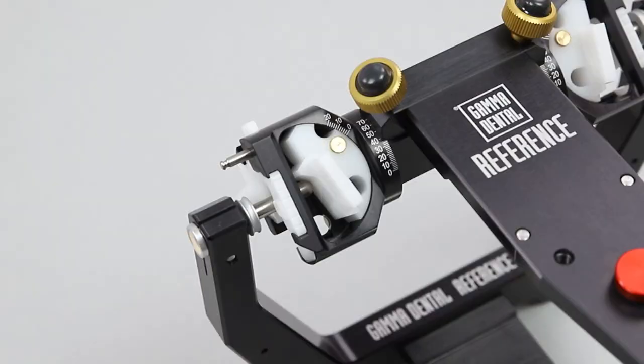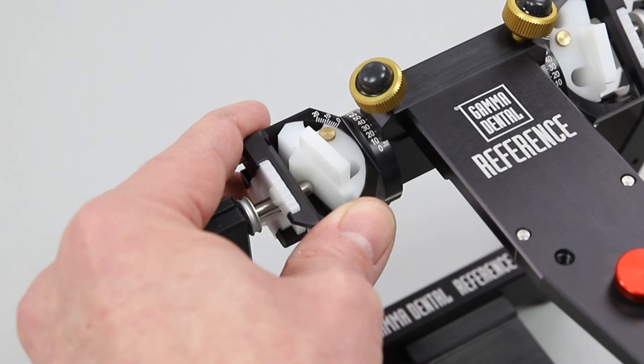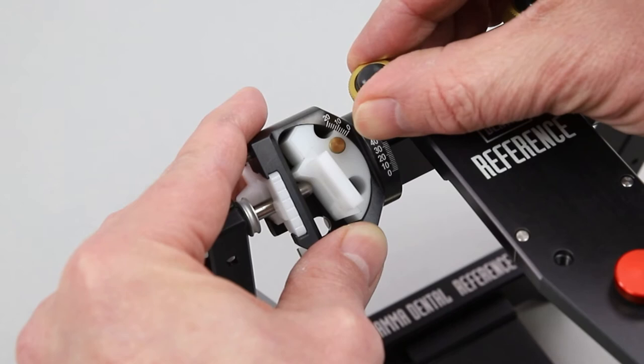The sagittal or protrusive inclination can be adjusted from 0 to 70 degrees by rotating the entire guide element. The fixation screw must be opened and closed properly again.